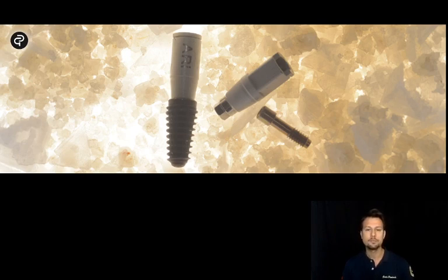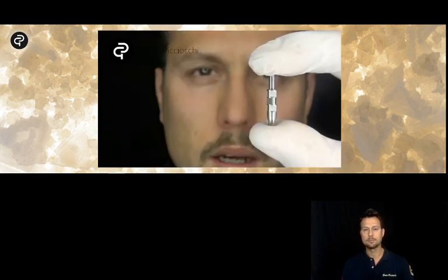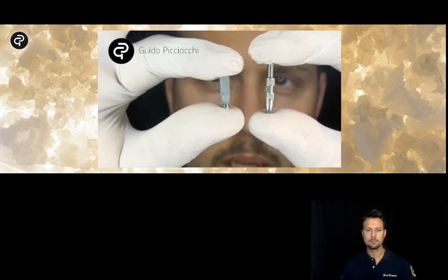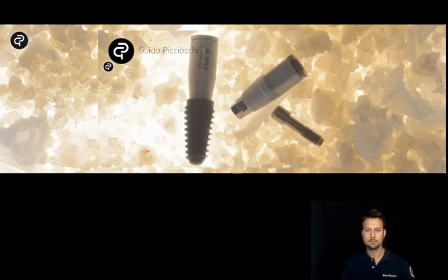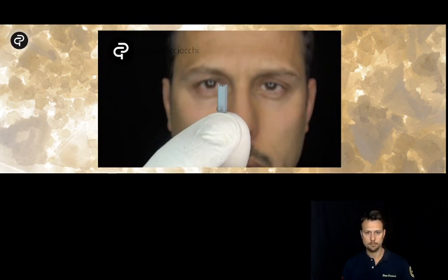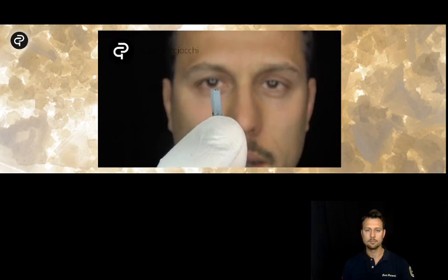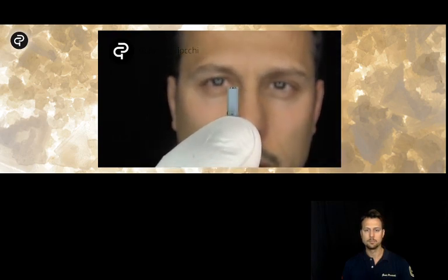When we use a dental scanner, the equivalent of the transfer is the scan body. A scan body is a plastic device that has some marks. Those marks should stay vestibular. In this position, the scanning will be easier.